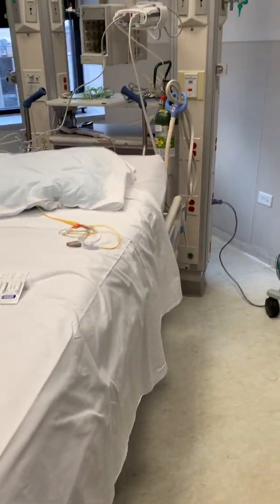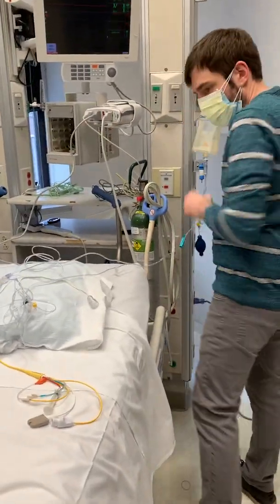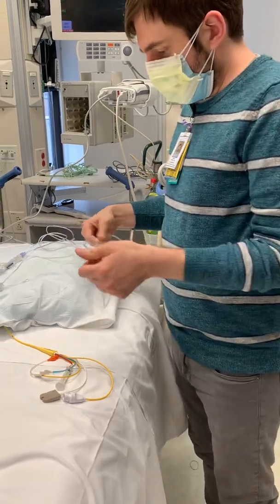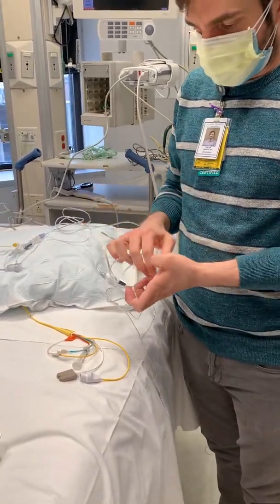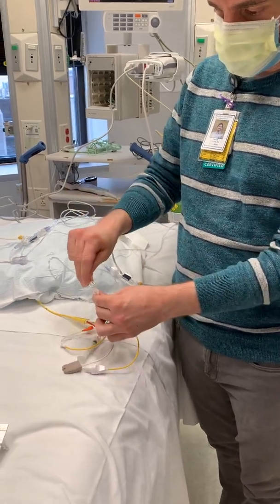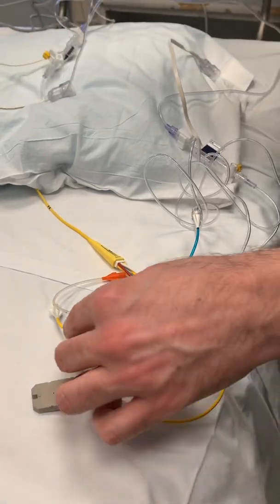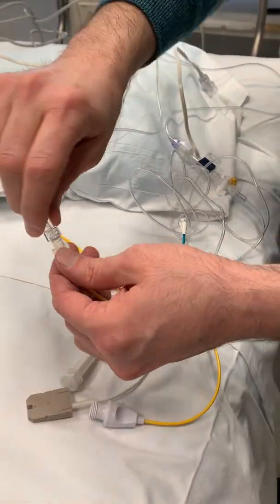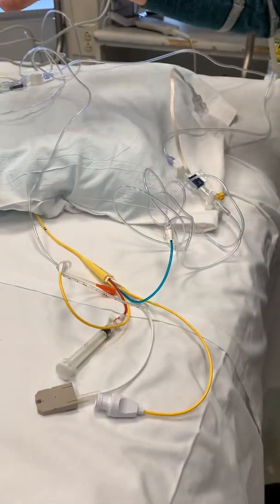You would set up your pressure tubing just like you would any other. So we would prime this, and then you're going to connect one to your CVP and you're going to connect one to your PA. It doesn't matter which one's which because we're going to figure that out in a little bit.